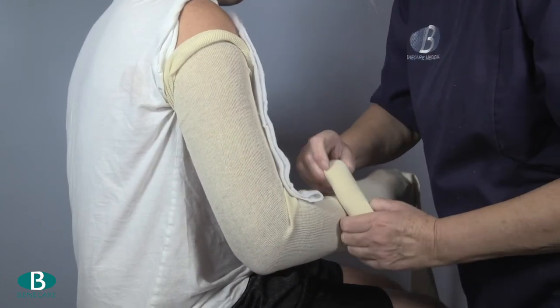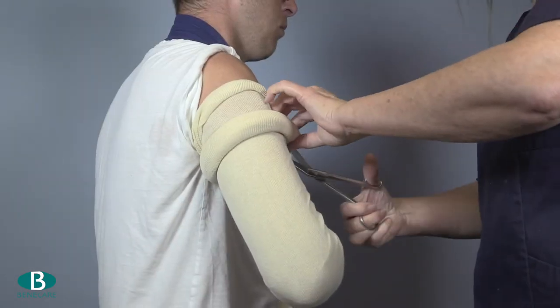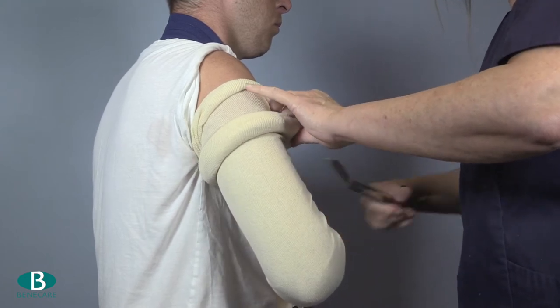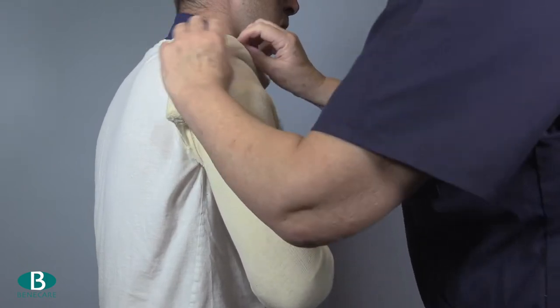Apply a second layer of stockinette. This needs to be measured from the elbow of the affected limb across the shoulders to the opposing elbow. Roll the stockinette up the arm, cut into the axilla and pull over the shoulder.